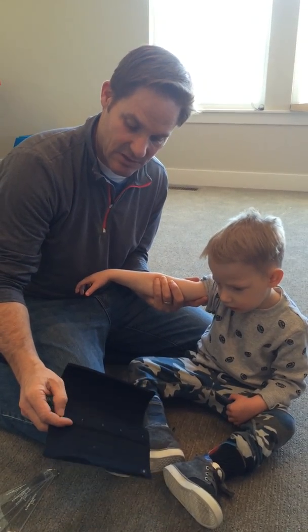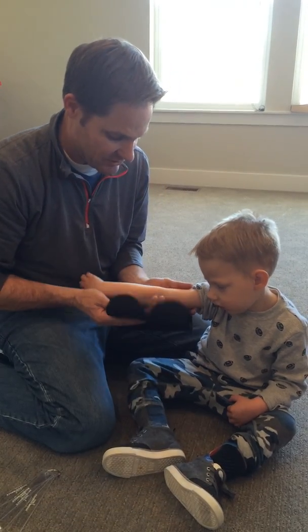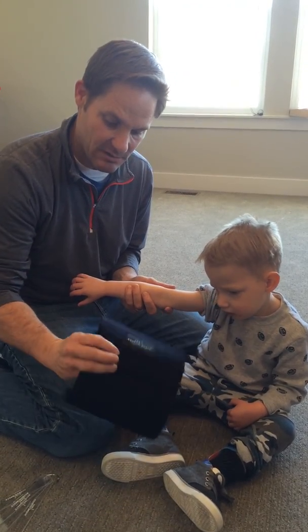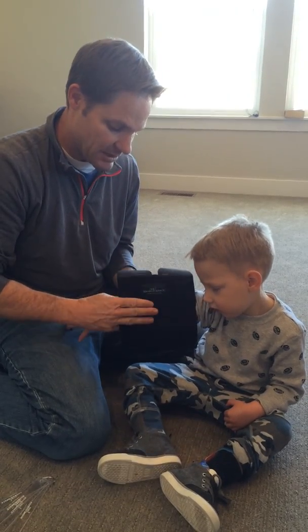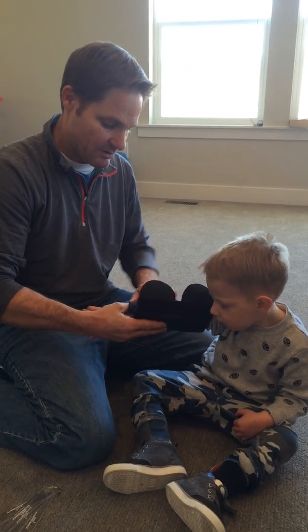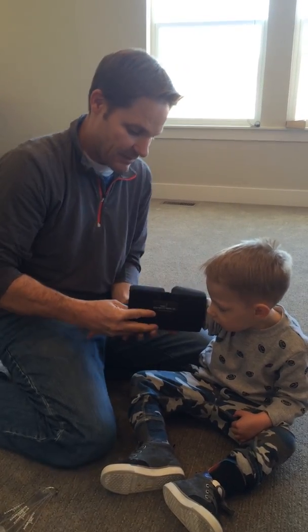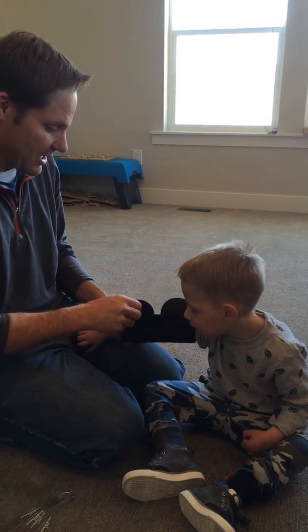We have some silicone on the inside that keeps it from sliding up and down or around his arm, and it's pretty easy. We take the stay part — we call that the channel — and we put that right on the inside where his arm bends. We divide it evenly above and below his elbow and then we wrap it around.